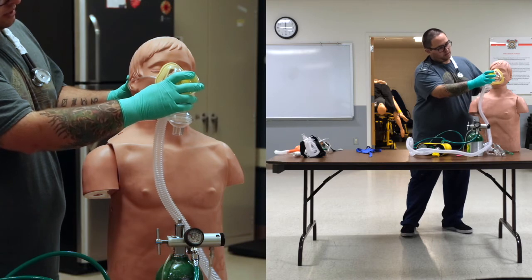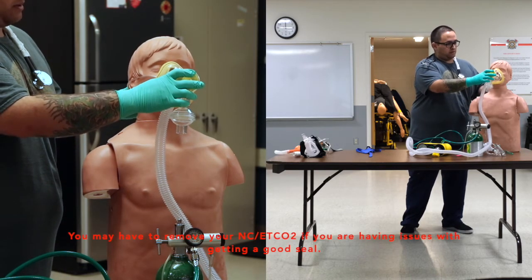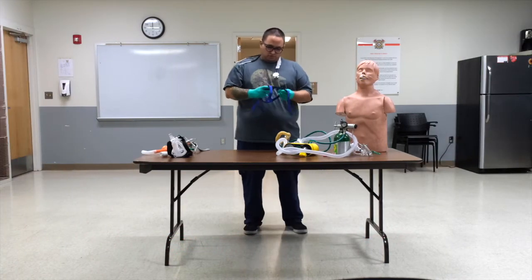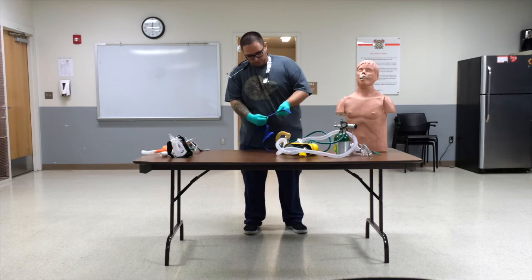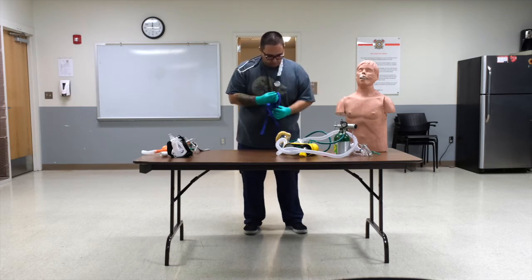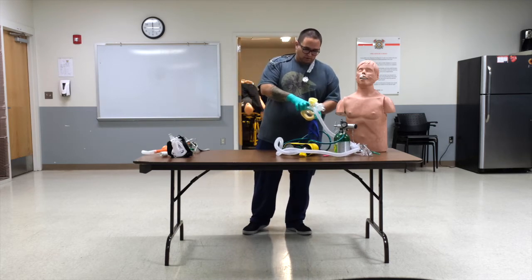Once they have a good seal, and if they're able to tolerate this well enough, we'll secure the mask to the back of their head. The straps that we use are like so. There's little holes on each leg of the strap, and that will secure in each of the pins that are on all four parts of the mask.